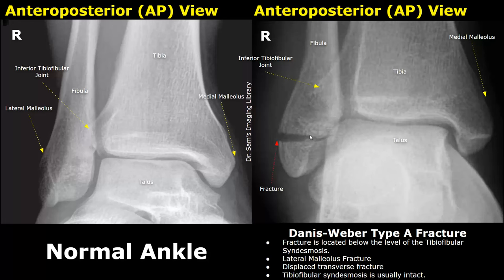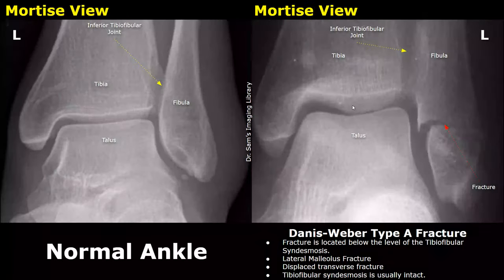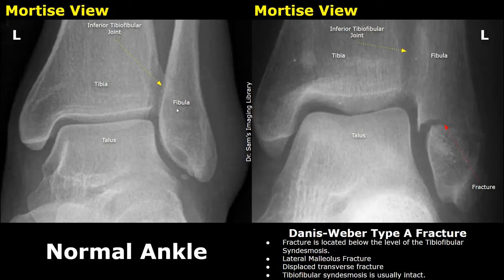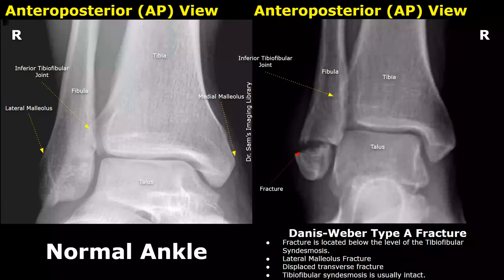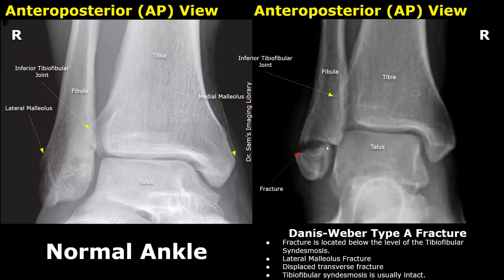This image shows a Danis-Weber type A fracture. There is a transverse fracture in the fibula at the lateral malleolus. The fracture is located below the level of the tibio-fibular syndesmosis, and the syndesmosis is not damaged. This is a mortise view of the left ankle, more focused at the ankle joint space. The fracture of the fibula is below the level of the tibio-fibular joint space, confirming a Weber type A fracture. Here is another case — a displaced transverse fracture below the level of the tibio-fibular joint with the syndesmosis intact.